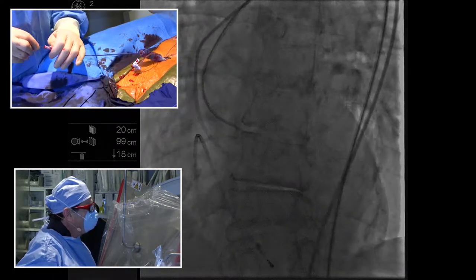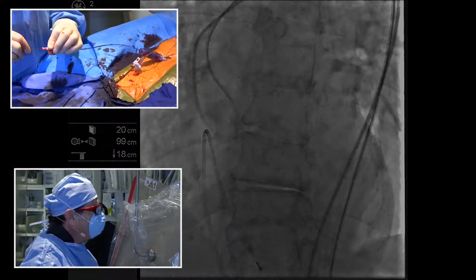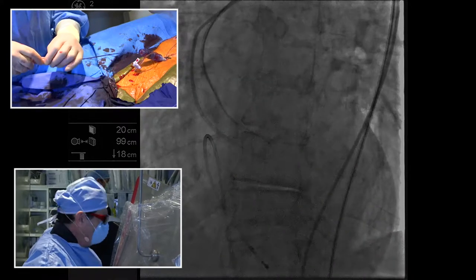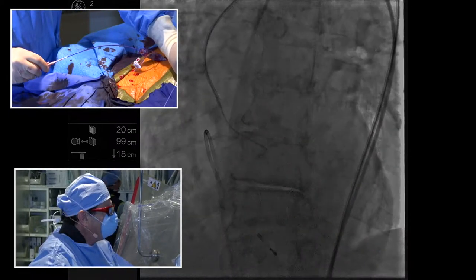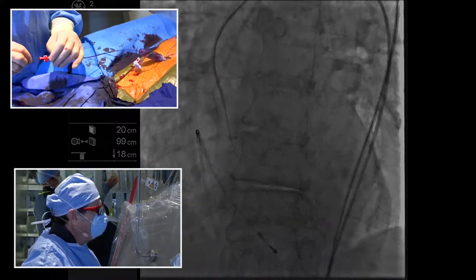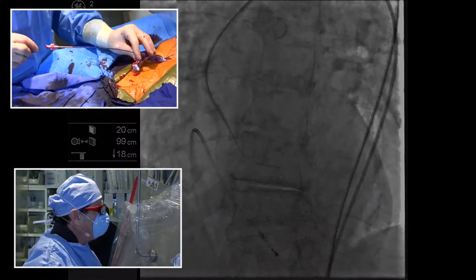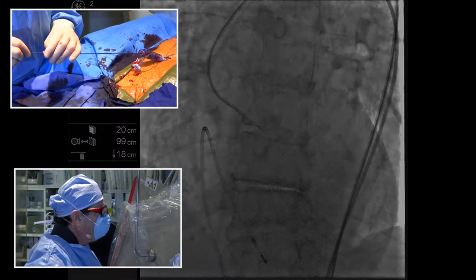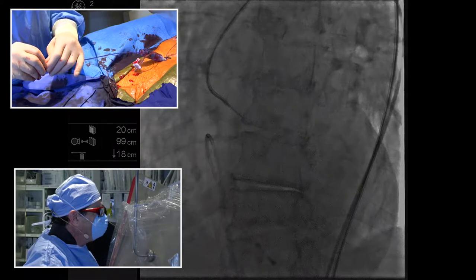So then we'll take a different catheter, a different shape catheter, which may put us in a different position. And it's just frustrating sometimes. It just takes time. You have a really calcified valve too. Yeah, but it's not that super tight. I'm just moving the pigtail away just to help my visualization, and it just seems like the right thing to do. Yep. So sometimes you can get a sense of where it is by the jet, by looking to see if the wire gets pushed. I'm not seeing it get pushed anywhere here.